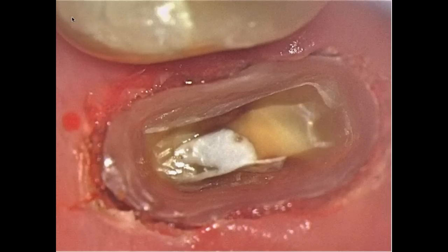First of all, Mr. Fossdal, what is the learning curve for the microscope? Well, of course it depends how often you are working with it. If it's just once a week, it will take a year. But if you're trying to use it most of the time, it will take about 1.5 to 2 months, and you will not miss it anymore. Wouldn't miss it.